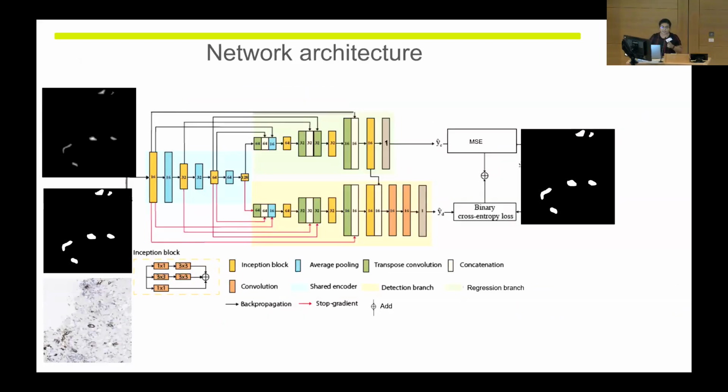So here is how we designed the model. This is the traditional U-Net architecture using an inception encoder with the filters redesigned. We have used one encoder and two decoder networks. One encoder and decoder takes the input and the mask so that it does the segmentation task. But we also generate a distance map so that it can be regressed, and then we apply mean square error as the loss function, and we combine those outputs to generate the segmentation output.